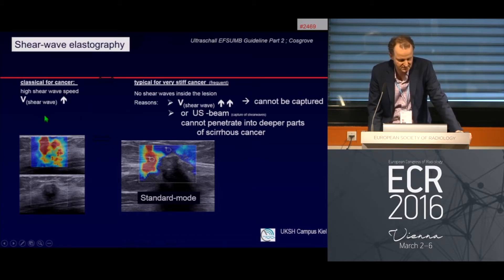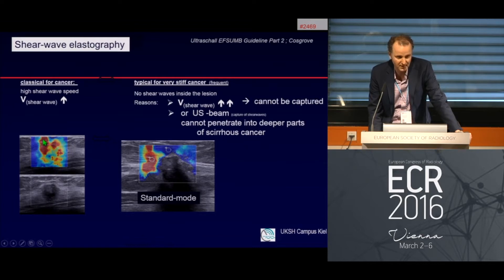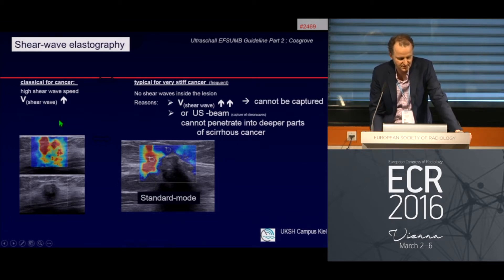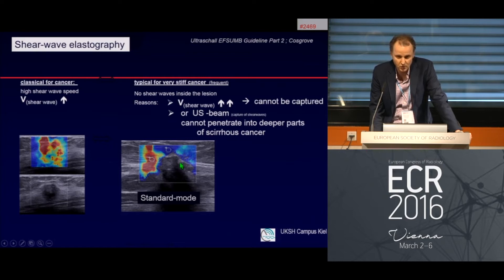Classic for cancer: we see a hypoechoic spiculated lesion overlapped by a very heterogeneous color — mostly red and orange — indicating a very stiff region. Classic for cancer is that we capture high shear wave speeds. We also often observe that around the lesion there are very stiff parts, but in the middle of the lesion there is almost no signal.